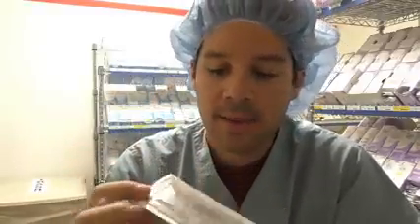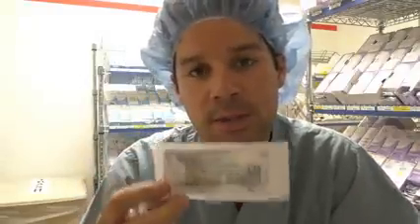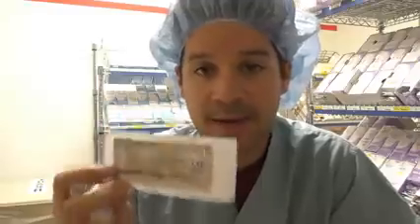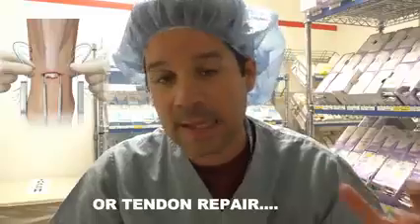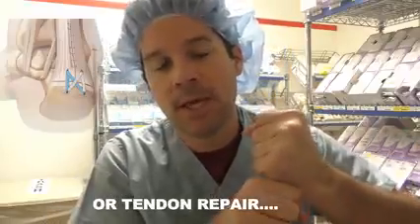Fourth and last multifilament suture I have for you here is the fiber wire. This is specifically and only used in orthopedic surgeries. Possibly podiatry, I don't know. I don't really do a lot of podiatry, so I can't say for that. But I've seen it used in orthopedic surgeries, and it's a very, very heavy suture that's used for kind of like a ligament repair type work to keep those bones together.